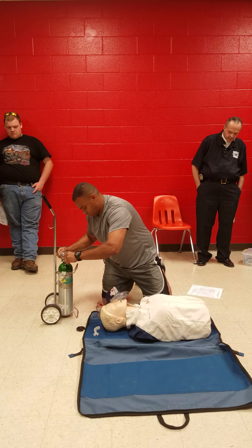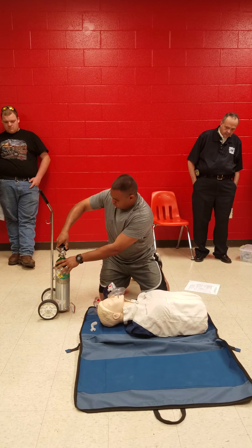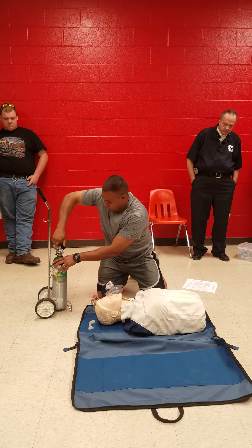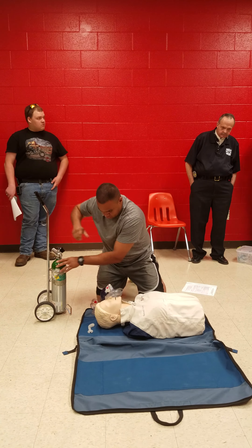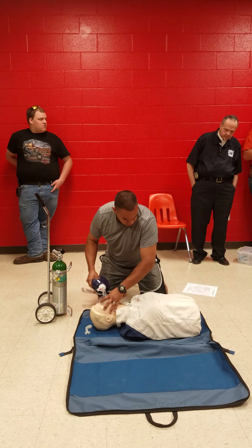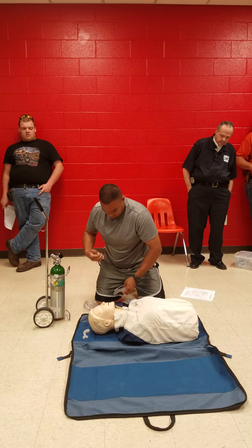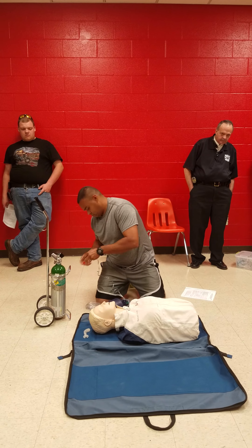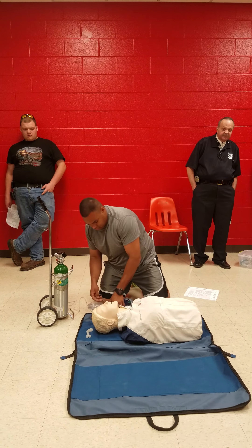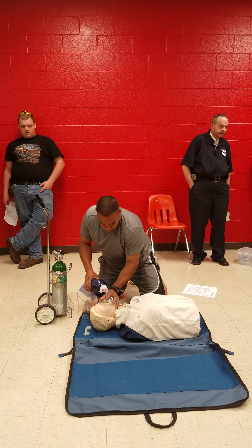Even though Wayne's getting good chest rise, if you're doing it and all of a sudden you see the chest doesn't rise, immediately give a second ventilation because the evaluator will keep the clock running. If he doesn't see the chest rise, even though you gave ventilation, he's going to keep counting. If he gets to 30 seconds he's going to fail people. So if you don't see a chest rise, give another one immediately. If it doesn't go up, reposition your head and do it.